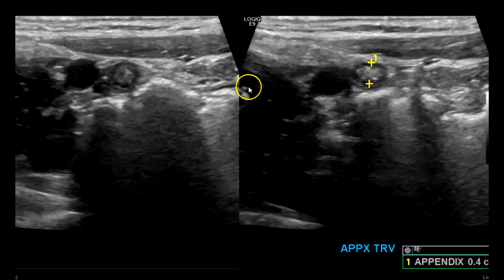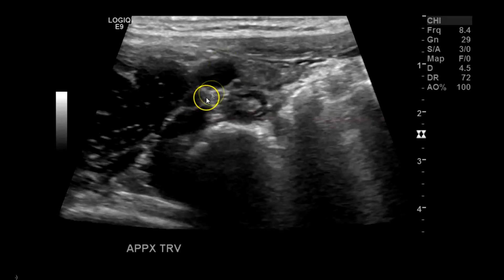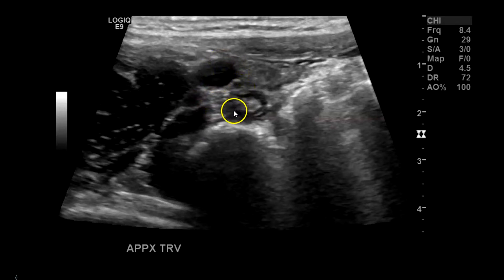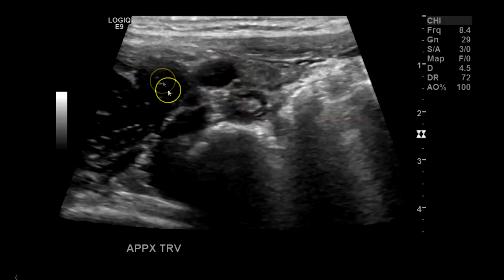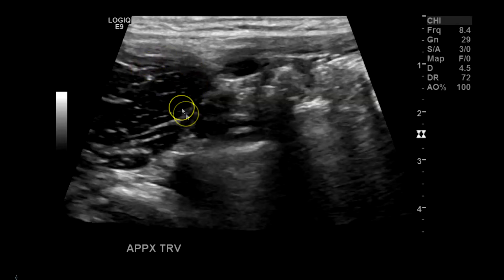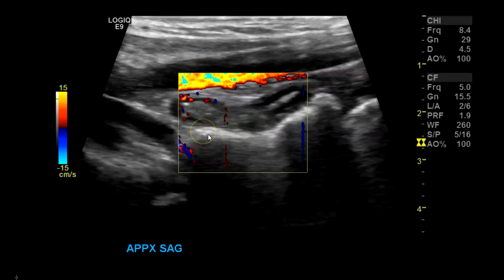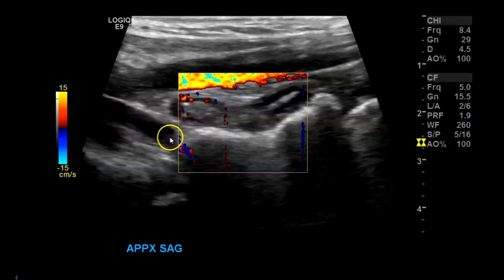So this appendix starts to dip down — 4 millimeters, so it's normal. You can see it starts to dip down further here. You've got your psoas muscle here. Further down — psoas muscle again. And here it's pretty deep. Here is your external iliac artery and internal iliac artery.